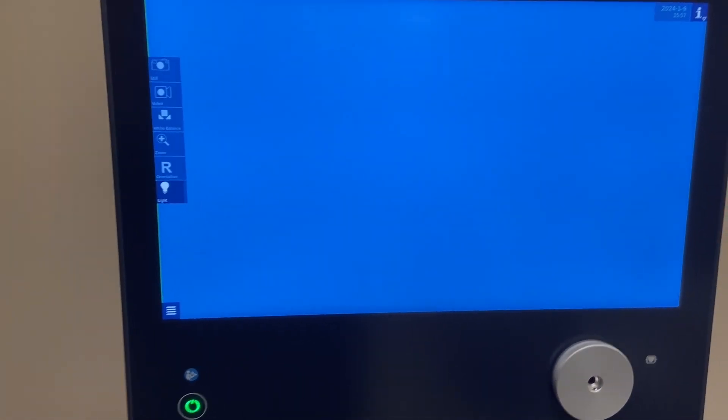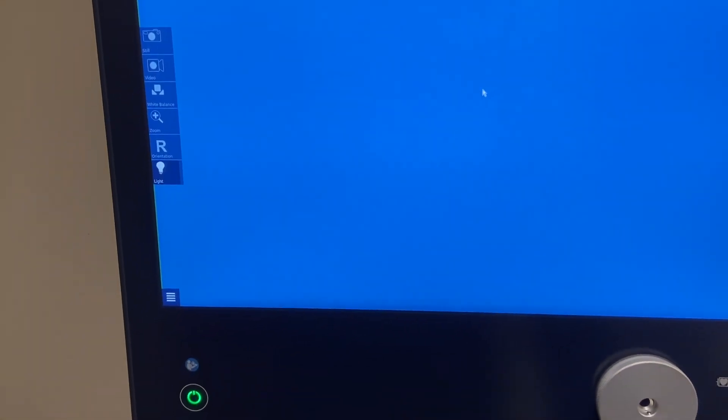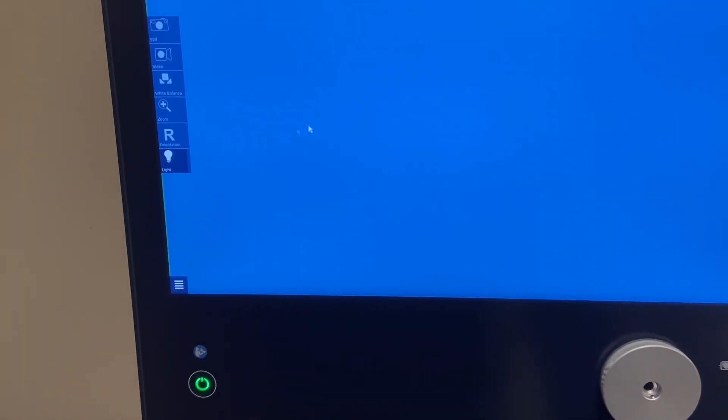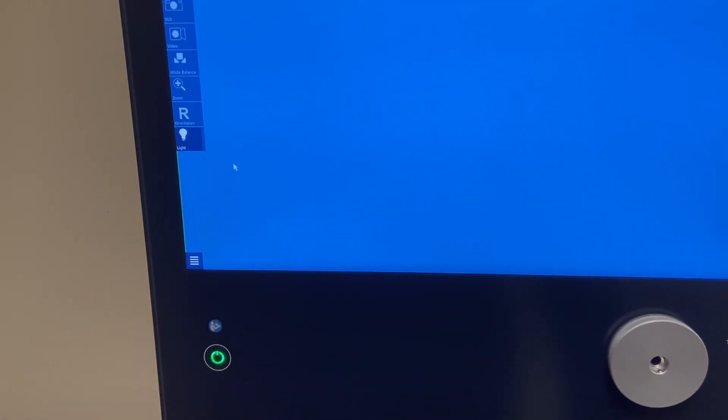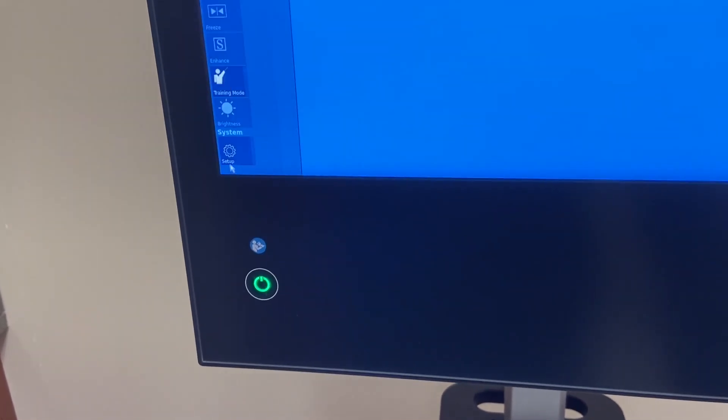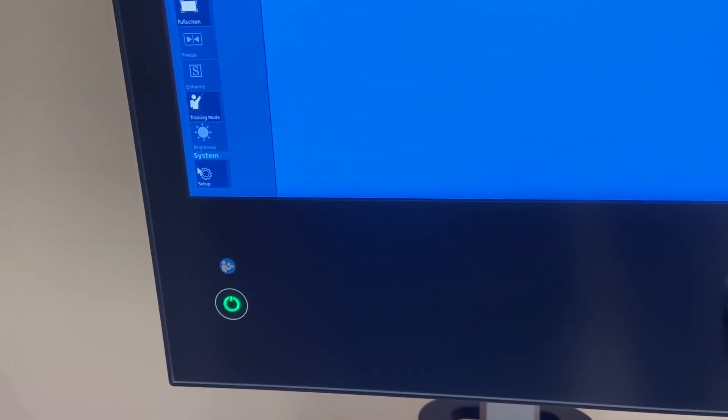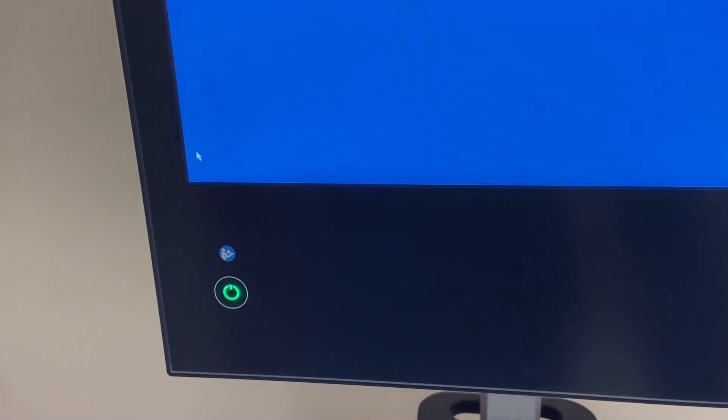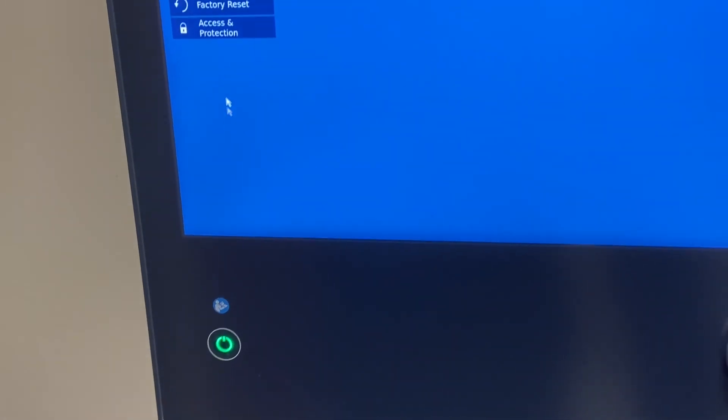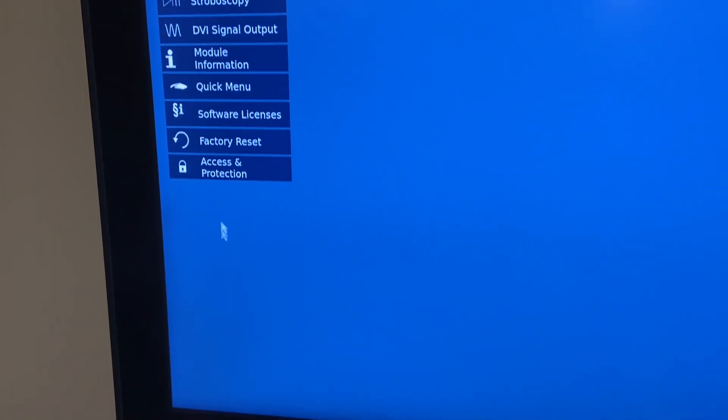I'm setting up a brand new telepack. In order to access patient info, you need to come down here to the menu, click setup, and then go to access and protection.